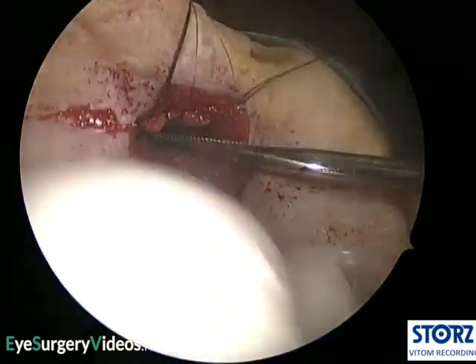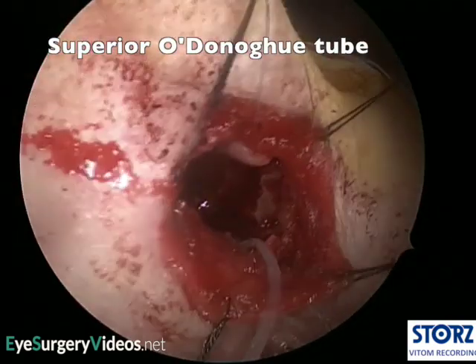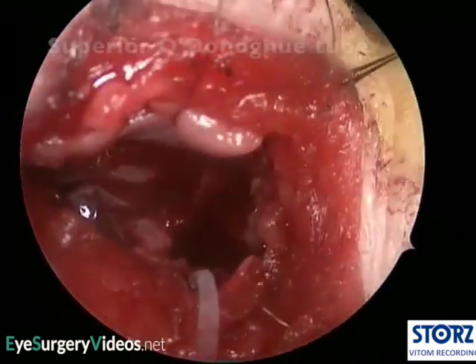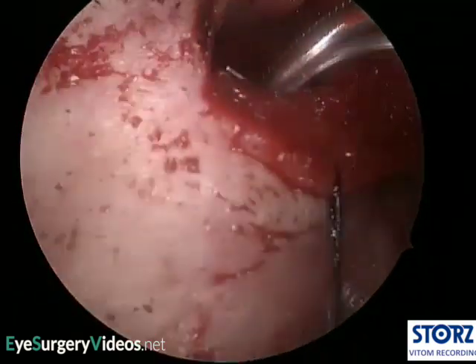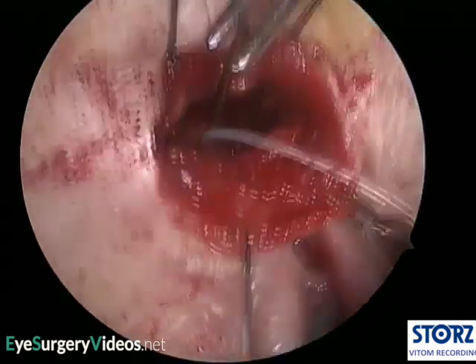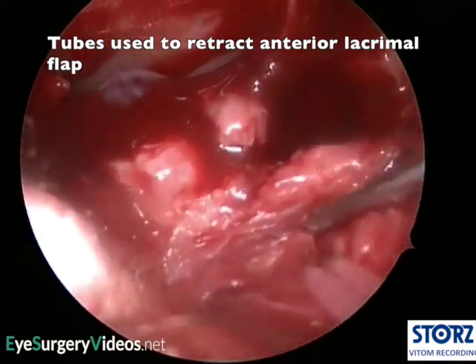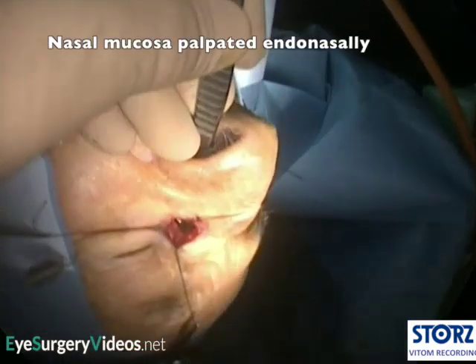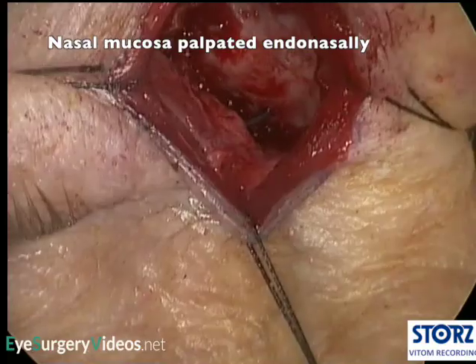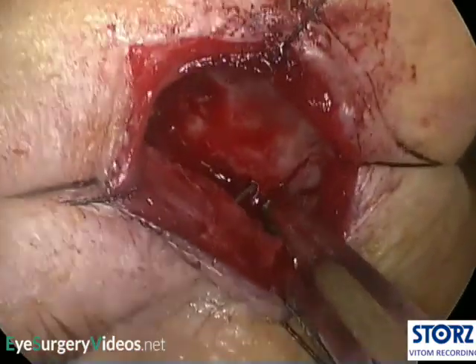This excerpt from another external DCR procedure shows the placement of O'Donoghue tubes. The O'Donoghue tube stylets have been bent into a gentle curve and are passed through the lower and upper canaliculus in turn. They are then clipped to the drape to retract the anterior lacrimal flap and medial incision edge. A cotton bud or blunt instrument, such as the Stallard being used here, is passed into the nasal cavity and used to palpate and tent up the intact nasal mucosa.